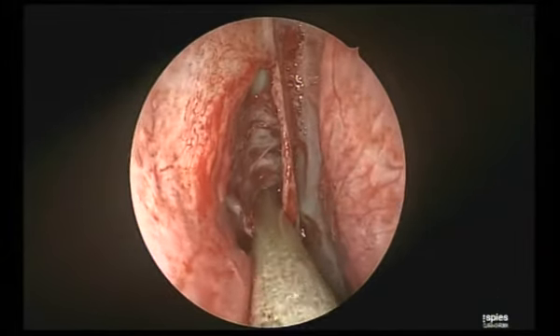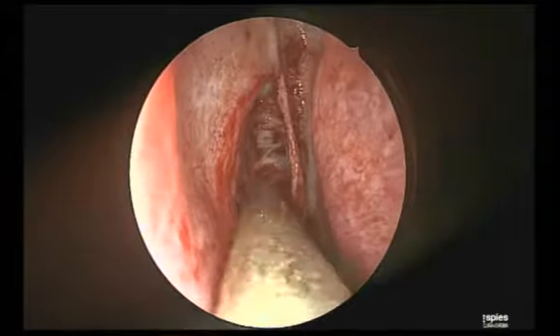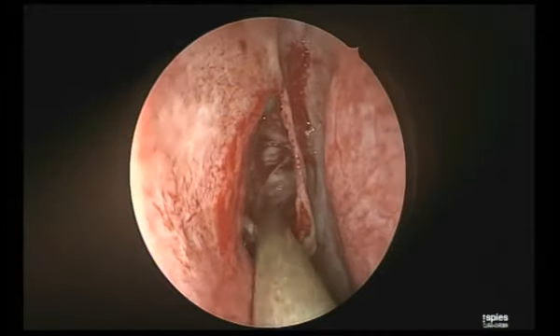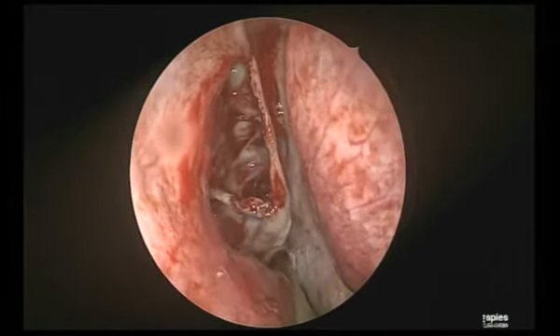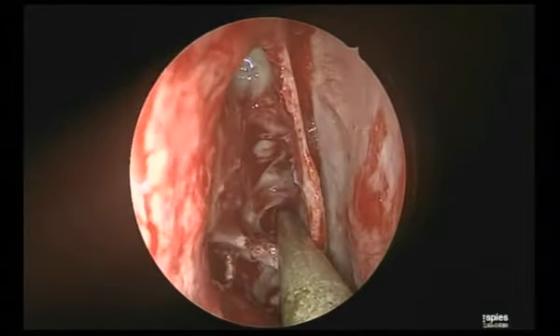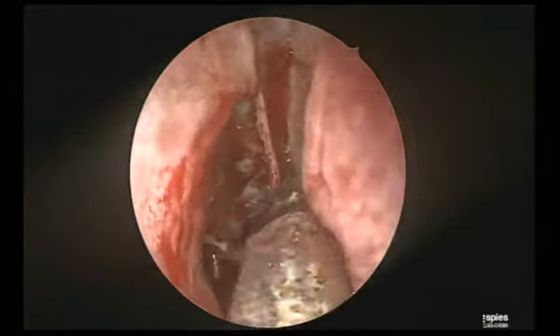Superb. See what I did, just removed a few millimeters. That section also was a flimsy one, so technically it was not even the turbinate. Believe me, this strategy works so well. See, our ethmoid access is so good.